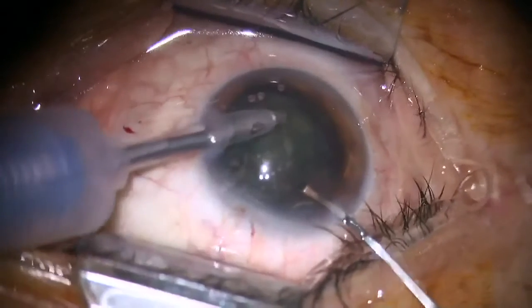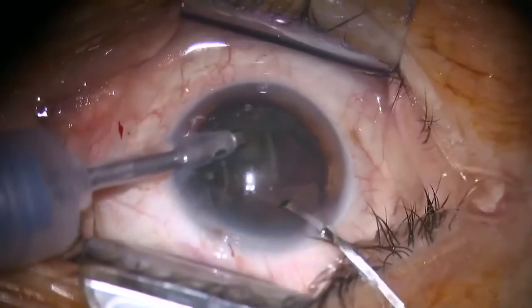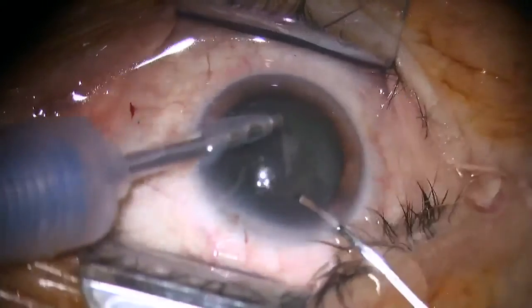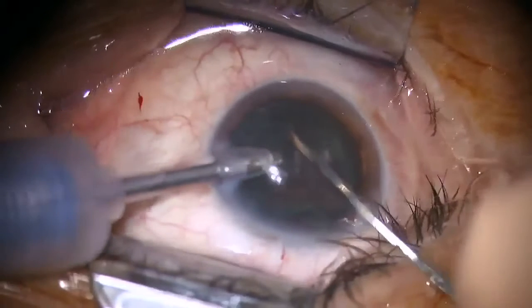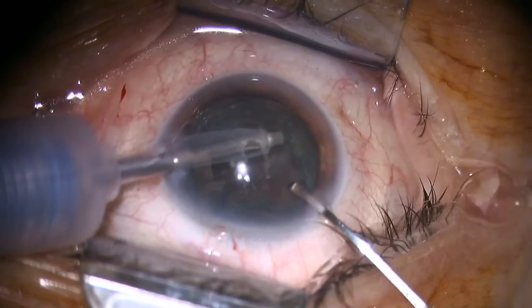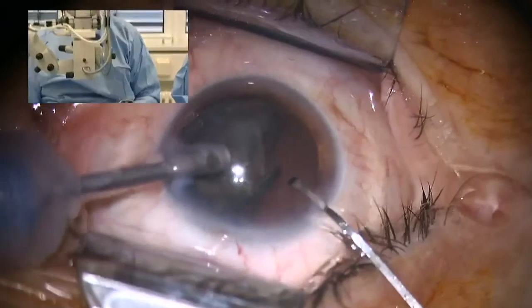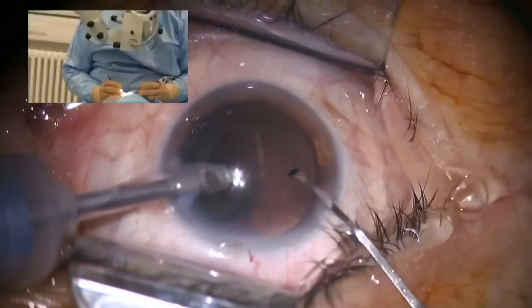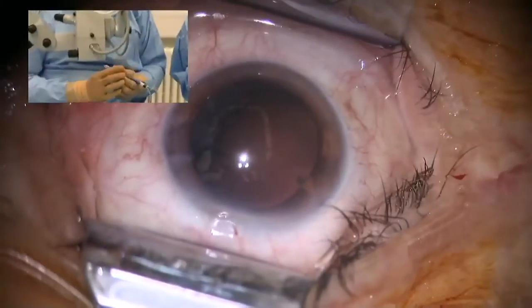You hear the clicking of the laser. This is, from my point of view, the surgical system with the lowest energy applied in the eye to remove the lens. As I told you, another point to focus on today is the disposable instruments. I normally use a modified new hand chopper as a double instrument with the push-pull on the other hand.